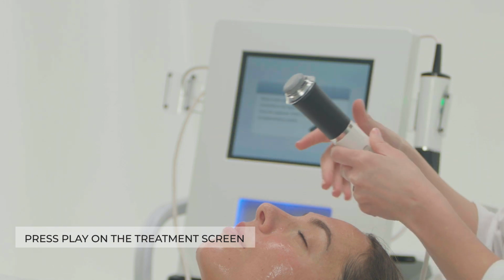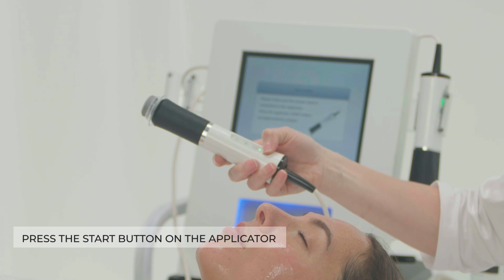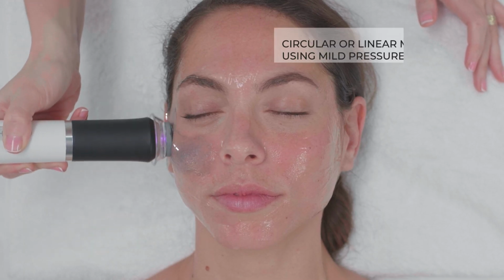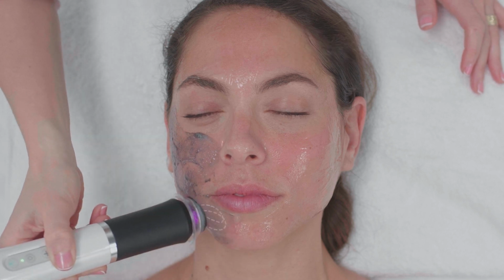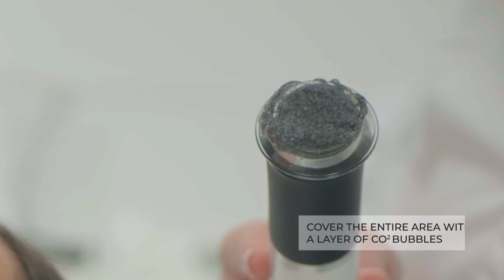Press play on the treatment screen and start the treatment by pressing the On button on the applicator. Work in circular or linear movements, using mild pressure over the entire chosen area. The goal is to cover the entire area with a layer of CO2 bubbles. Avoid contact with eyes and mouth.